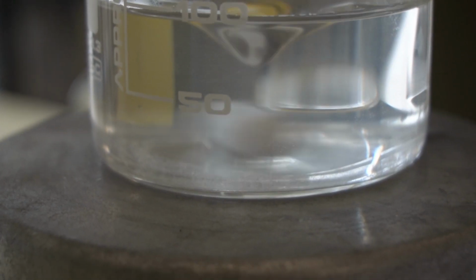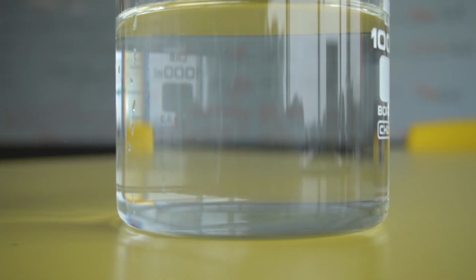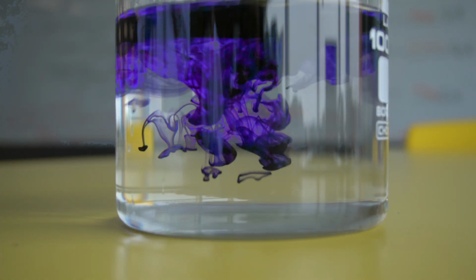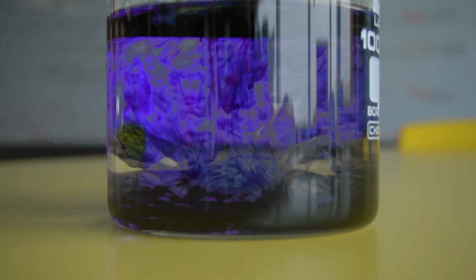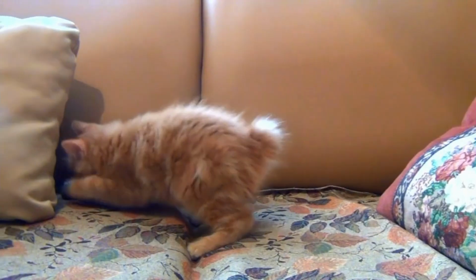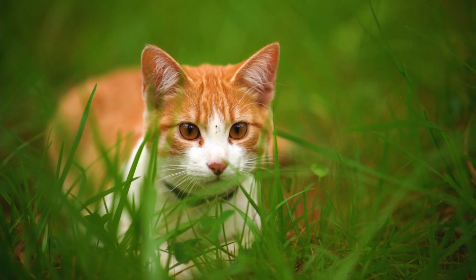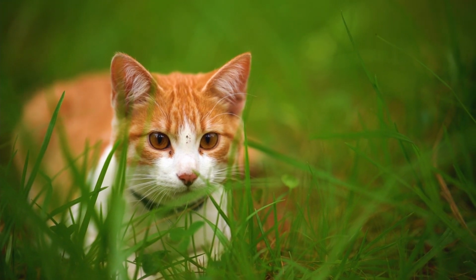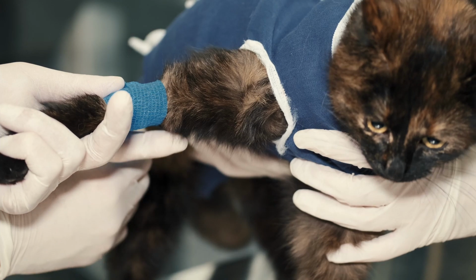If there isn't any change in color in the litter, there is nothing for the owner to worry about. However, if it turns purple, it is indicative that the cat potentially has abnormal amounts of glucose in their urine. As stated, this is crucial in the early diagnosis and prevention of feline diabetes, and it could make it efficient for owners to notice if their cat should be taken to the vet.